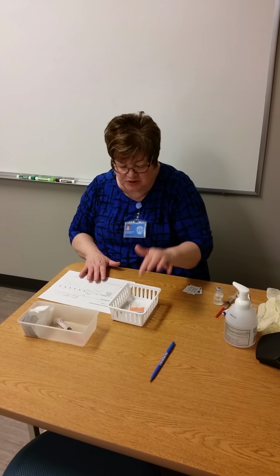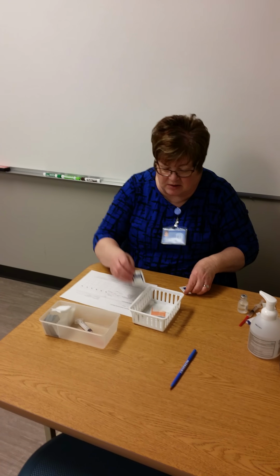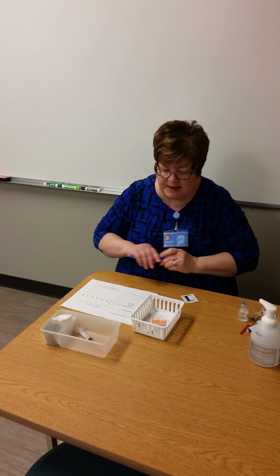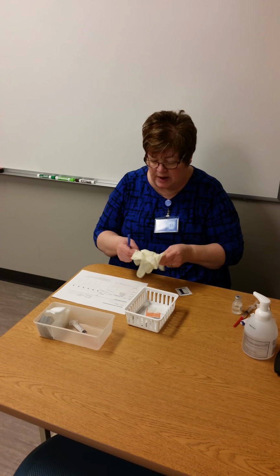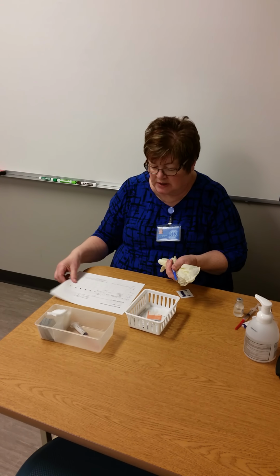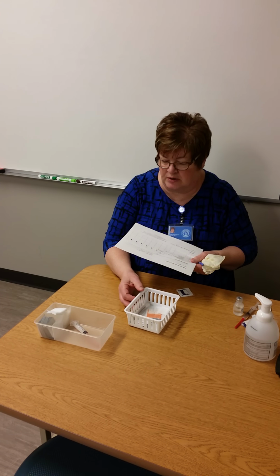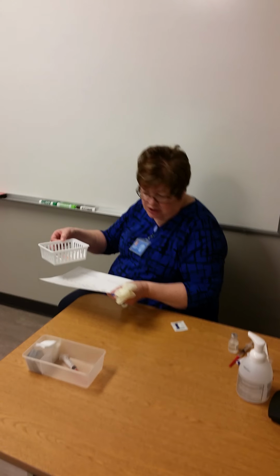Okay, I have my Tubersol in here. I have a little piece of gauze. We're going to throw in an alcohol pledget in there. My pen, my MAR, I have a pair of gloves. Now, when you're drawing up your medications, if your institution says to wear gloves, you wear gloves for your own protection, okay? So, we're going to now go into the patient's room.